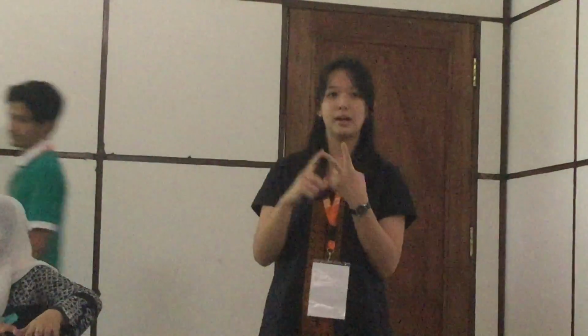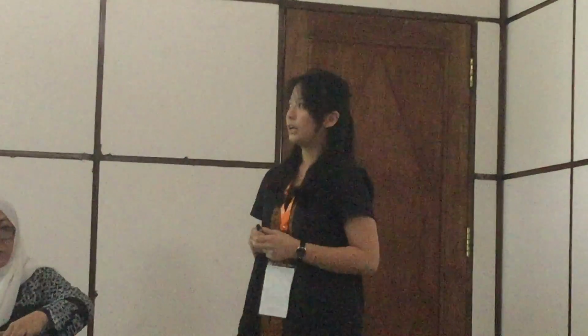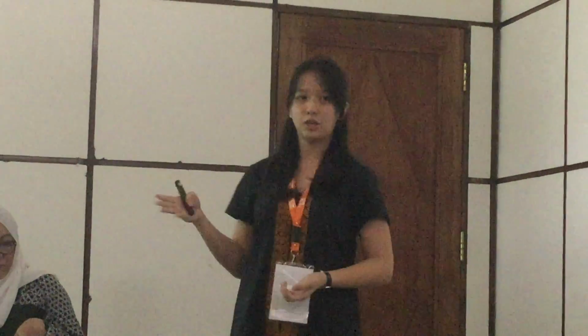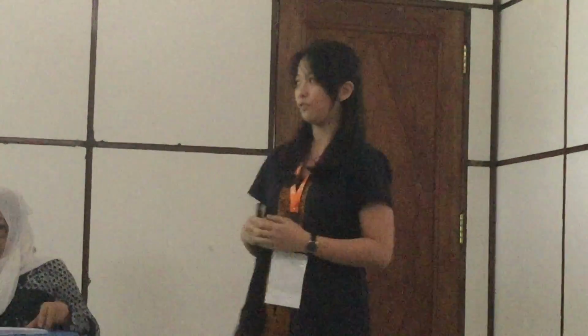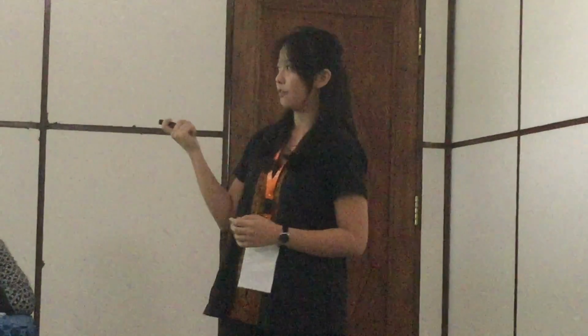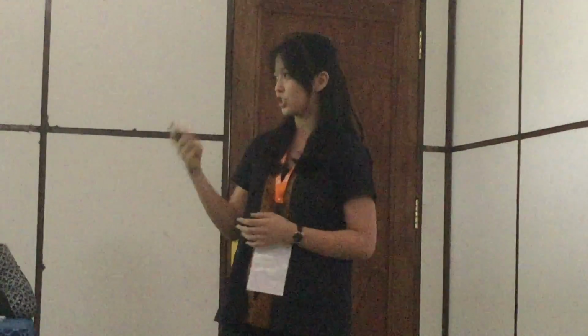So there are two ways to diagnose SAO. First is by manual microscopy, and the second one is by using PCR to detect the changes in the gene. But there are some problems. There is a high prevalence of ovalocytosis in malaria endemic regions, but there is a limited number of experts, and manual examination is time-consuming. Therefore, we developed this automated detection to observe the changes in the morphology.